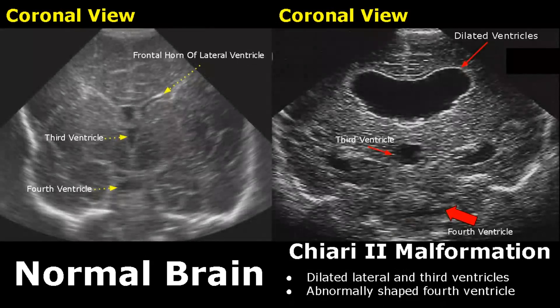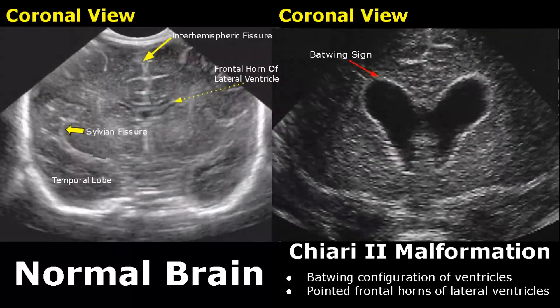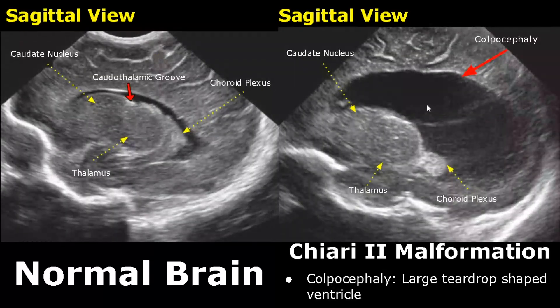This is a coronal image showing dilated lateral and third ventricles with an abnormally shaped fourth ventricle — you can see the difference in shape and location of the fourth ventricle. Batwing configuration of lateral ventricles is another feature, due to pointed frontal horns.